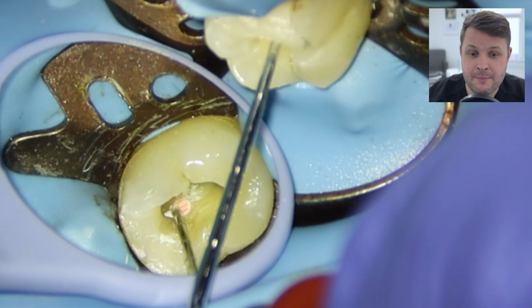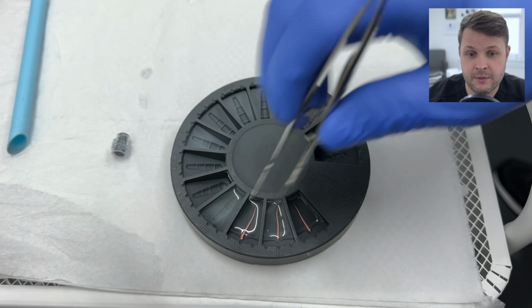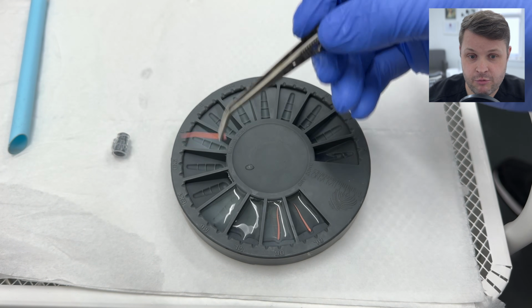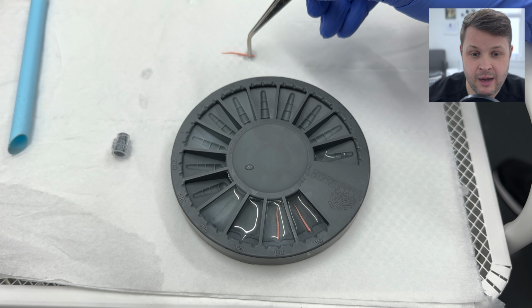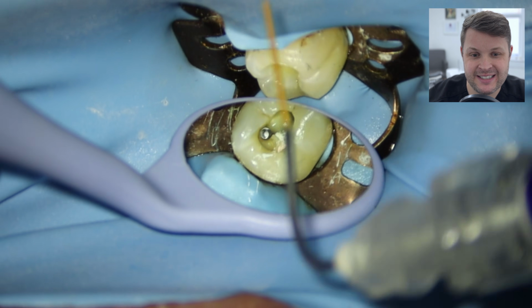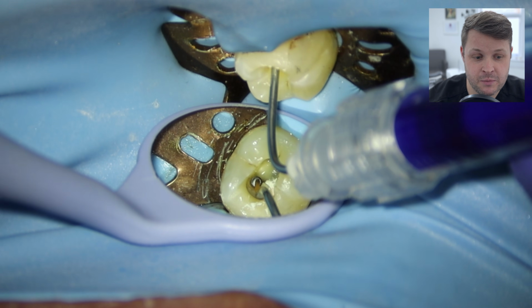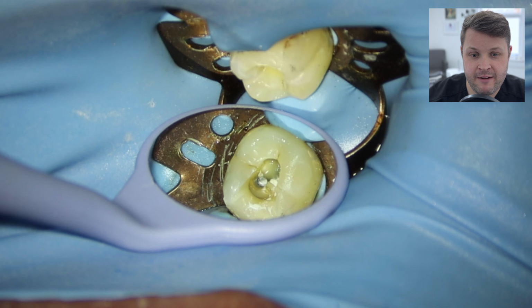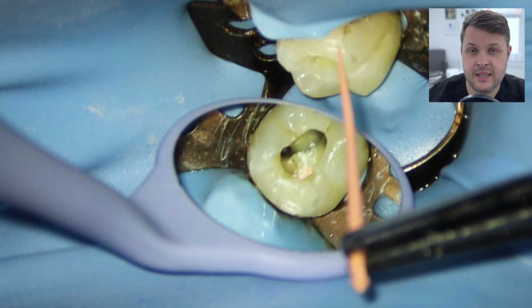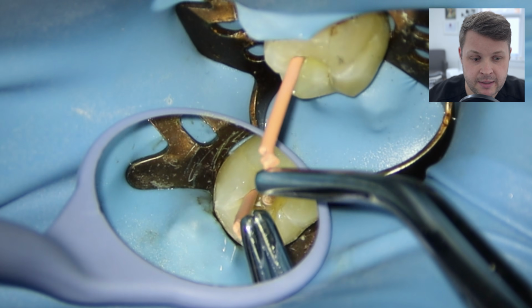And then it's the same protocol. I'm going to pick up the GP point, crimp it down, remove the excess, place it to the side, ready to go, and then we're going to place our bioceramic sealer into the mesiolingual canal, and then place the GP cone to length, very, very gently. It's just the same thing, nice, easy movement, very gentle. Don't push it down. Take your time.